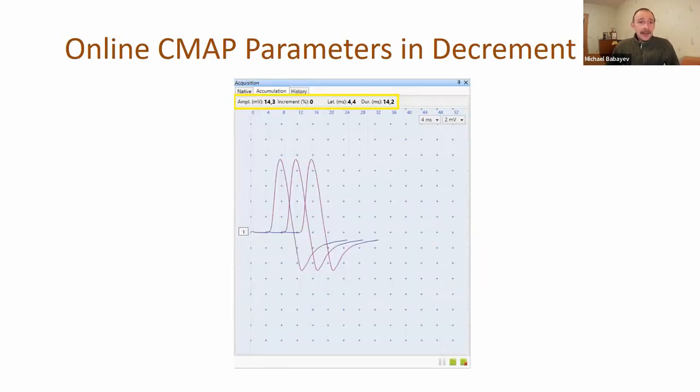We added online CMAP parameters in the decrement test. Now, for example, just after the second stimulus in a series, you can see and estimate the decrement.